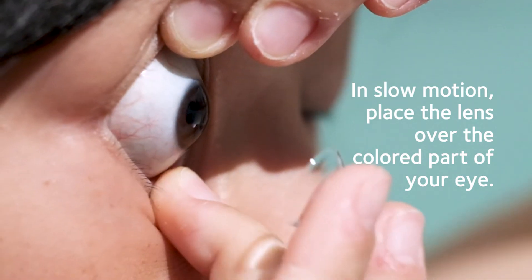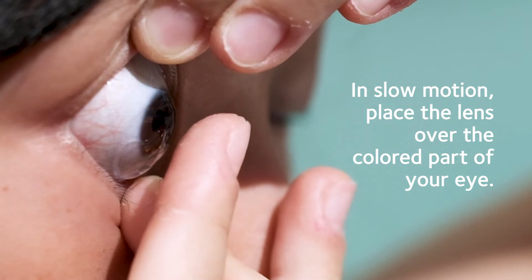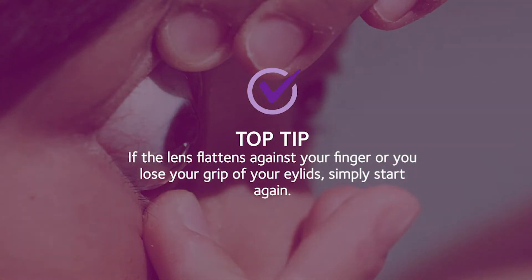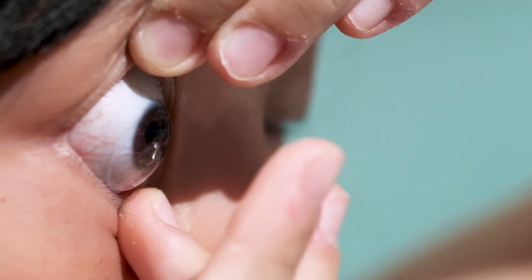Now concentrate on keeping your eyes open and look straight ahead into the mirror. In slow motion, bring the index finger carrying your contact lens towards the colored part of your eye, making sure you keep your grip on your eyelids. If the lens flattens against your finger or you lose the grip of your lids, just stop, make sure the area around your eye and fingers are dry, and start again.